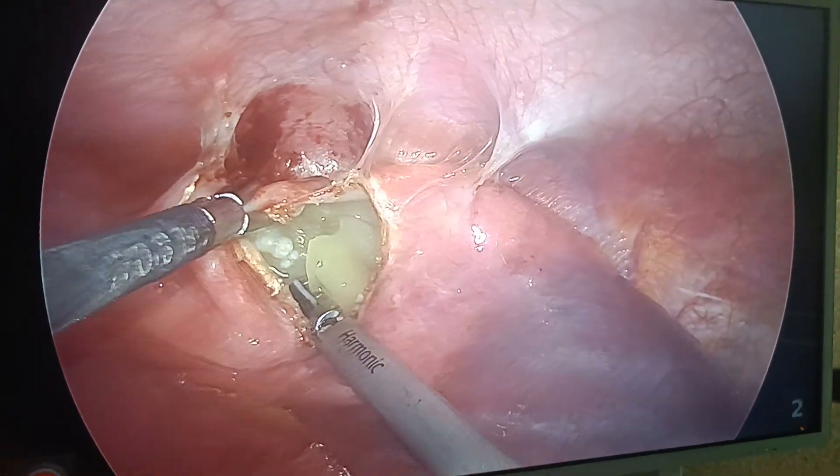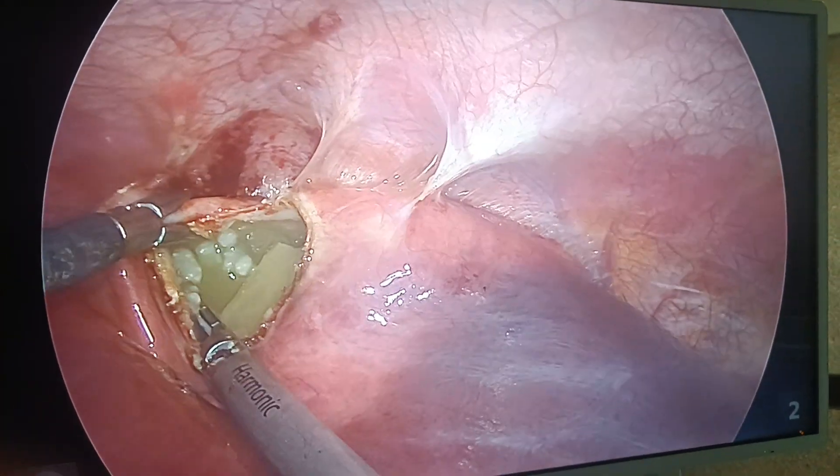Can you appreciate? This is the hydatid cyst content. Can you see the daughter cysts? Can you see this?